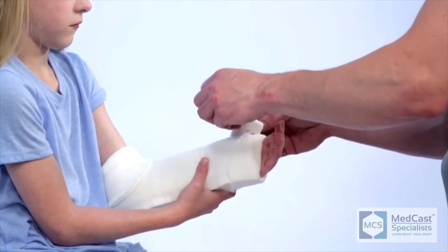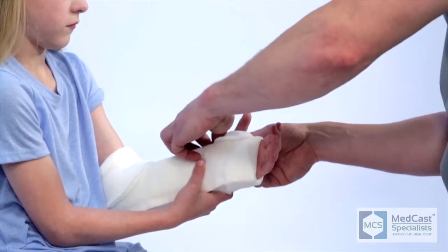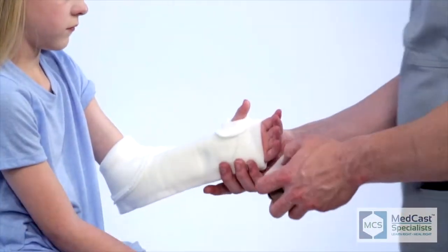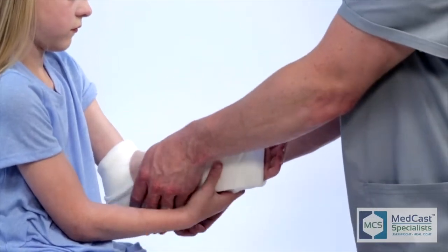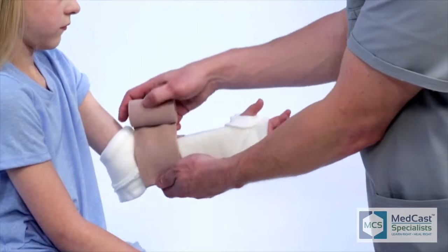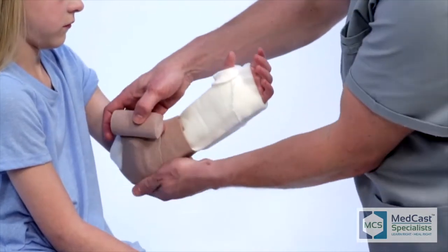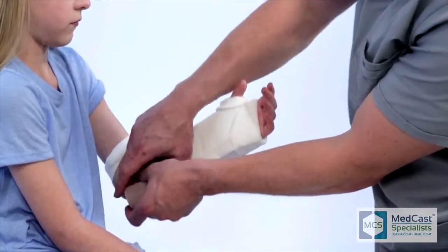We start proximally wrapping to anchor the splint, and then wrap posteriorly. This helps hold the splint and keeps it from migrating posteriorly. It's not going to move distally if we have it wrapped in place, so that keeps the splint right where we want it.